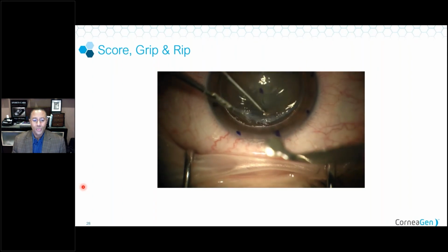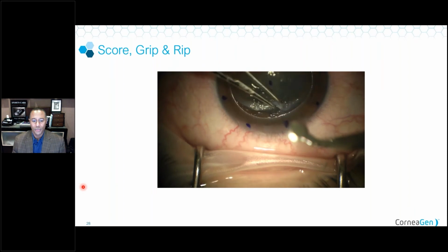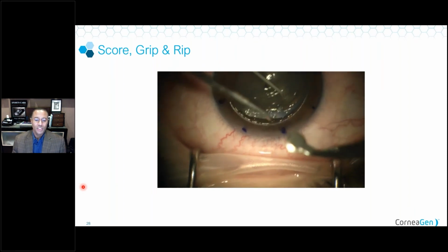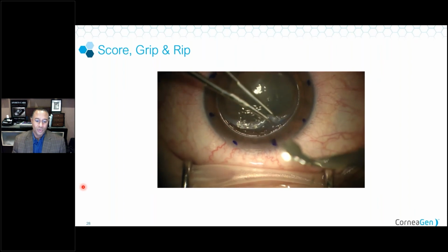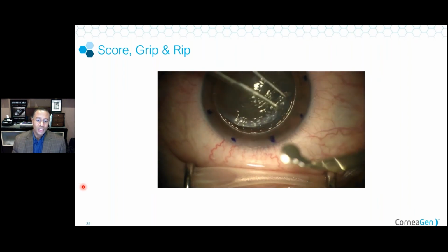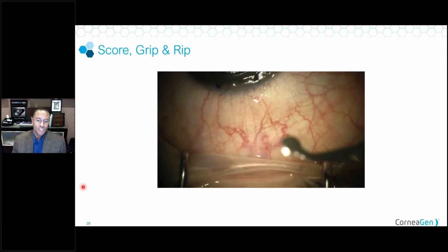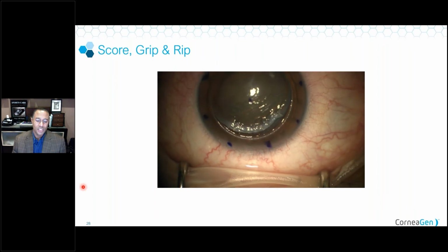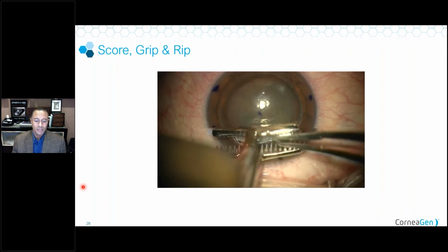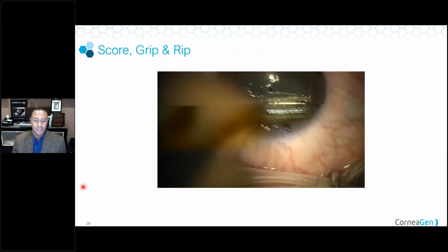I used to do this with 0.12 forceps, and because of the amount of pull that you're doing with those 0.12s, you'll actually start to damage your 0.12 forceps, and you'll go through them really fast. So that's where we started to use the green forceps, because it's just a heavier forceps that allows you to get a really good grip. So we use the 0.12 just to make sure that I can get a good grip with the green forceps.